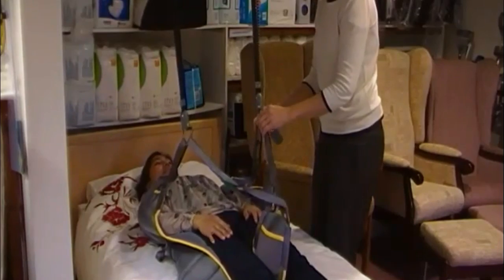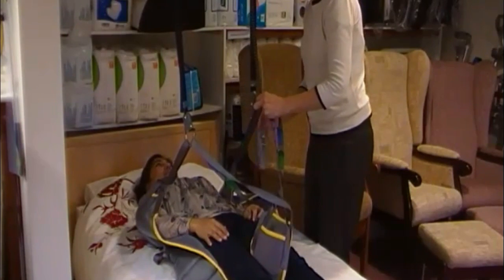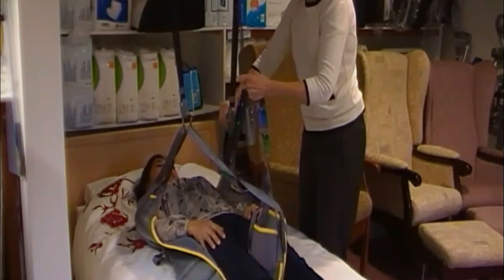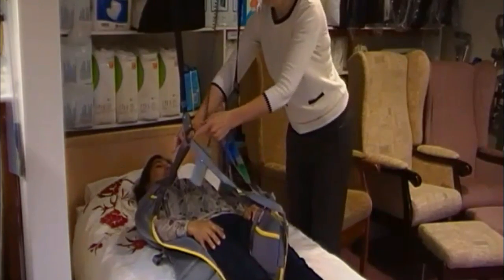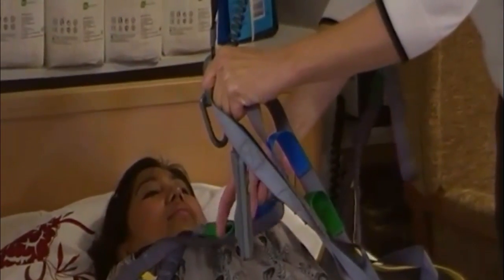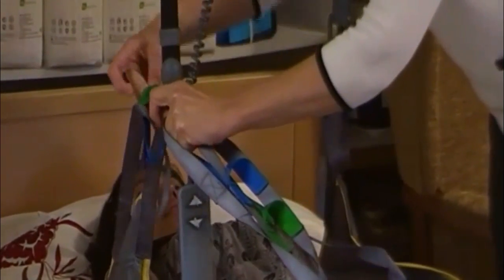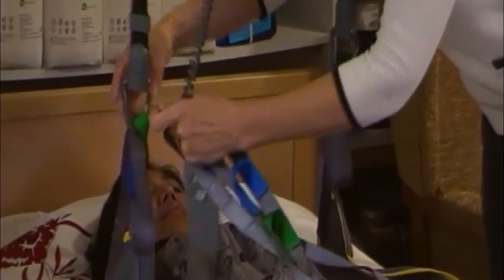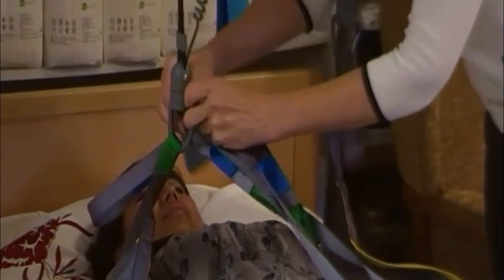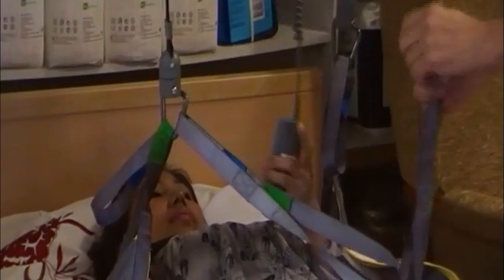That's lovely. Now what I'm going to do, because we're going to take you back onto your chair, I'm just going to put this on a shorter strap so that you're slightly more sat up. Okay, so we'll go onto the green, that side. And the green here. And then when I pick you up, you'll be in a more upright position. Okay, put these back on. You can do this yourself. But there you are. And you'll be in control of what's going on.